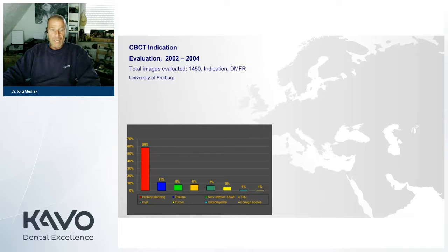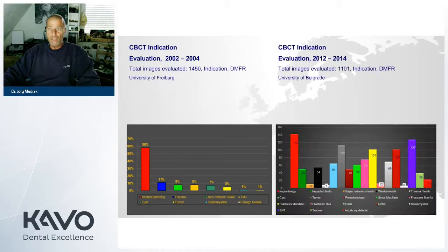Most of the colleagues had been still relying on the old-fashioned, conservative way, like extra and intraoral 2D imaging. And if we now check the indications of 2012 to 2014, where we did this evaluation, you can see that there are basically still the same indications we had 10 years ago, but there are more. That means the technique is getting more and more popular. You see more and more indications to use this, and that's why we now need, of course, the adoption of our ability to analyze data.